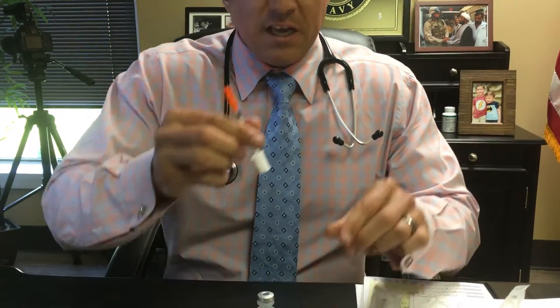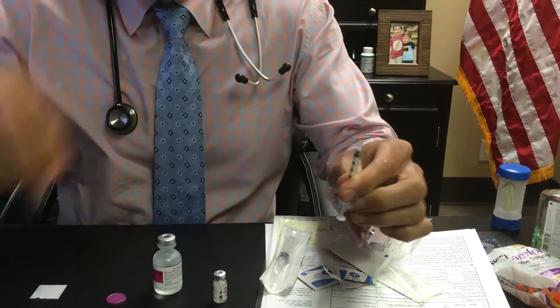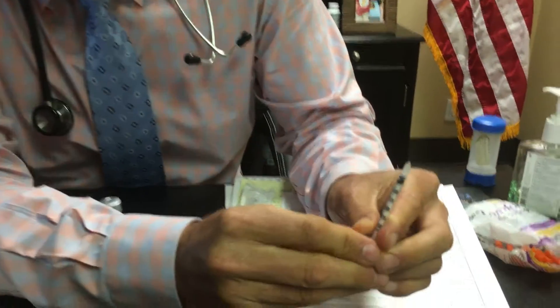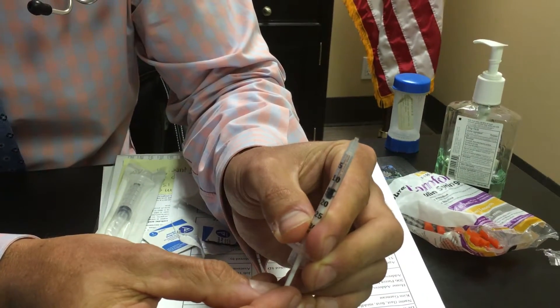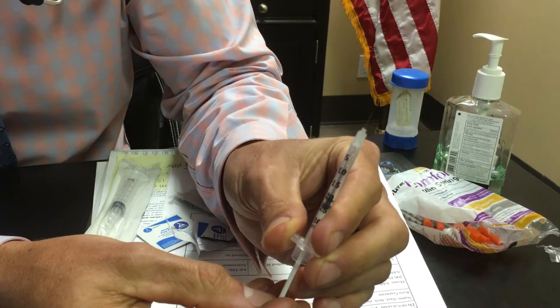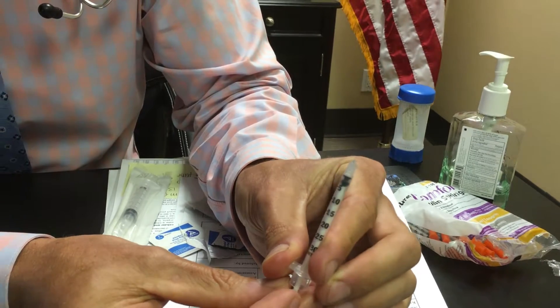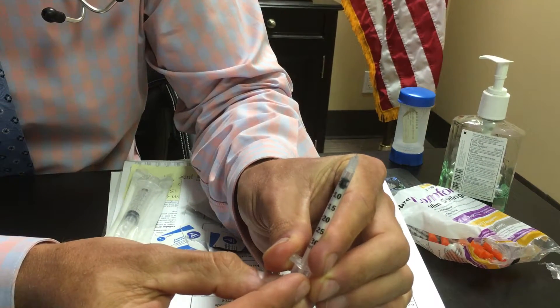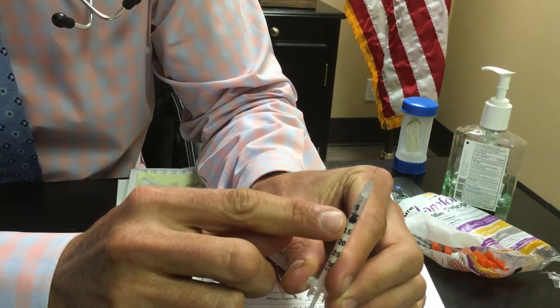To inject this, you want to get out your 0.3 cc insulin syringe. The cap comes off at the bottom and the orange cap comes off at the top. These syringes are marked 5, 10, 15, 20, 25, 30 — that's 0.3 mls to the 30 line. Generally, to start, I'm going to have you pull to the 7.5 line, which is midway between 5 and 10 — that's 0.3 milligrams.